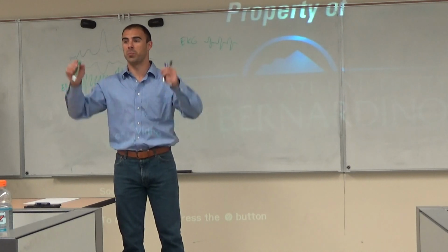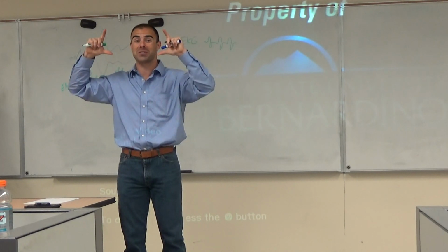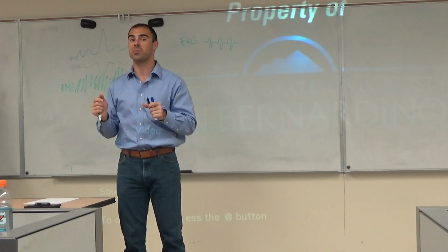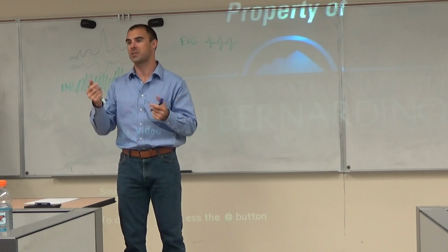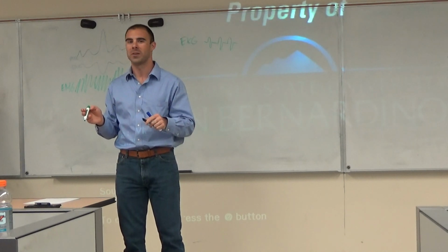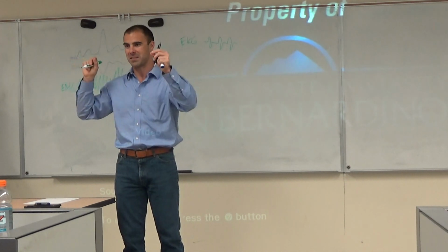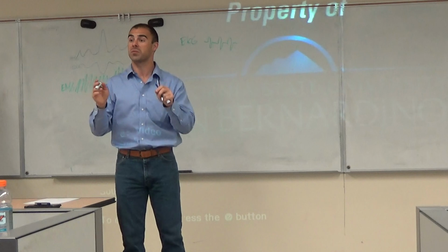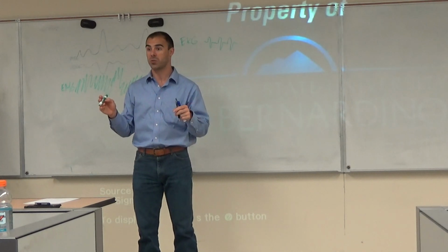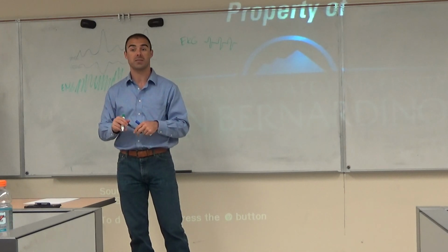Yeah, so instead of blinks, which are not actually the eyes but the muscles of the eyelids, HEOG is actually movement of the eyes horizontally. That's the H, right? And of course that's also reflecting some muscle activity, because you have the muscles on the side of the eyes making that happen. But the eyes themselves are moving this time. So if you're reading left to right on the screen, or looking around, you're going to have these artifacts, HEOG, these saccades.